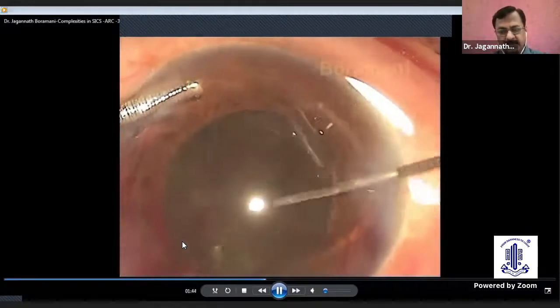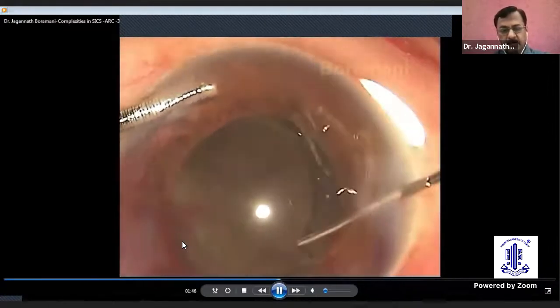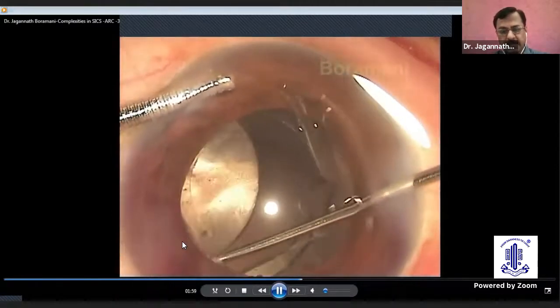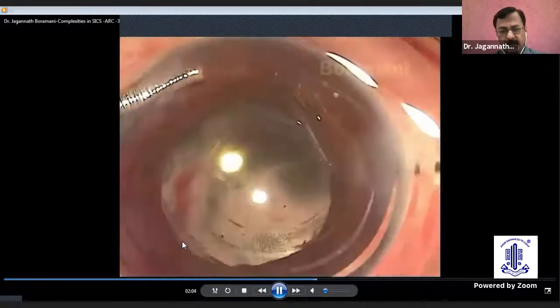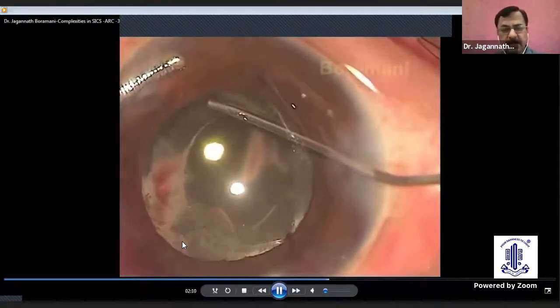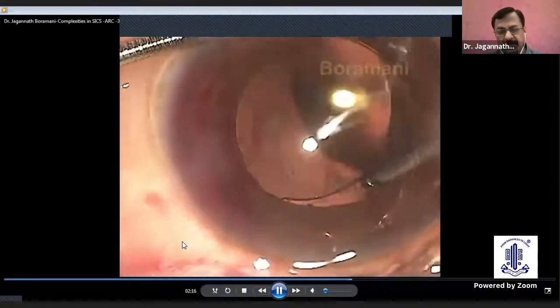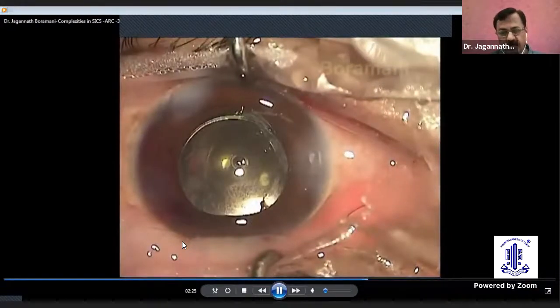Perhaps it is better to use a rigid lens for such cases — it will give good support. When I am placing the other haptic, I am not doing any major rotational movement, but slowly just pushing towards the dialysis area, and now I am manipulating the upper haptic. This way, the major zonular dialysis is managed without a CTR ring, and then you complete the remaining part. During cortical aspiration, I am giving support to the lens so that it supports the weak area, and then gently aspirate. The aspiration cannula is supporting the optic of the lens, and this is the final picture — almost a normal picture of this case.